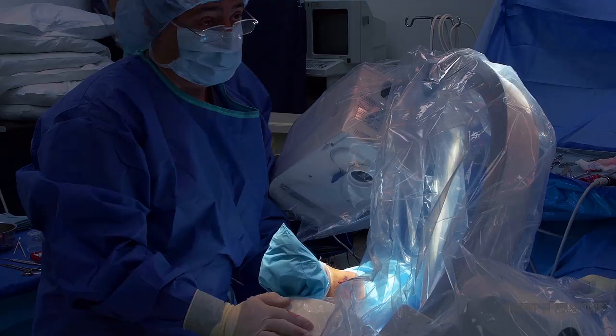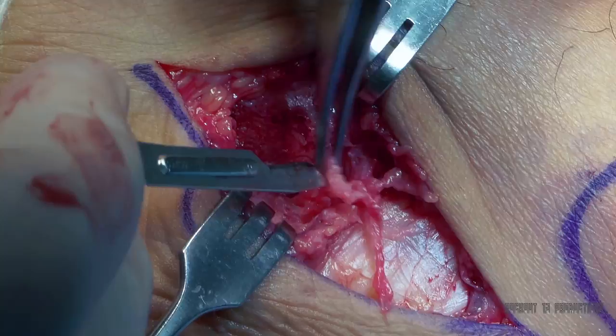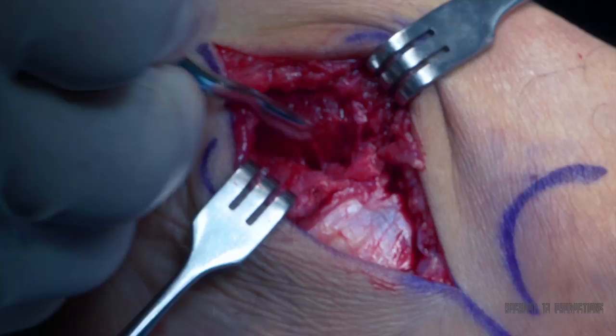The area is irrigated to remove any small remaining bone fragments and confirmed with intraoperative fluoroscopy. Any hypertrophied synovium can be excised. The posterior aspect of the navicular, where the accessory navicular articulates, is rasped.